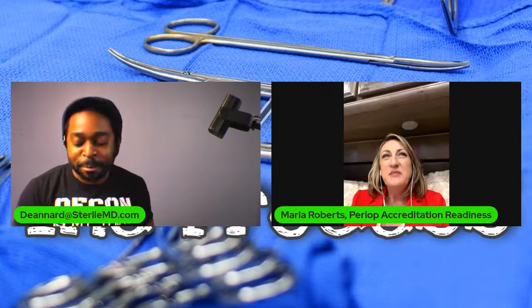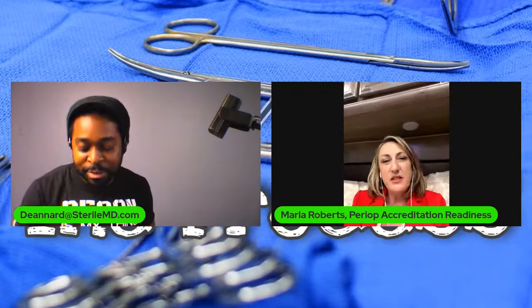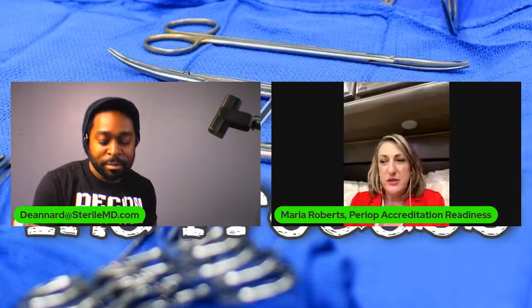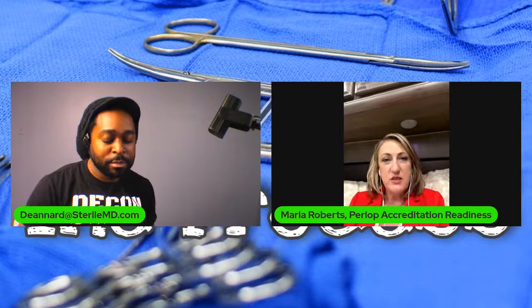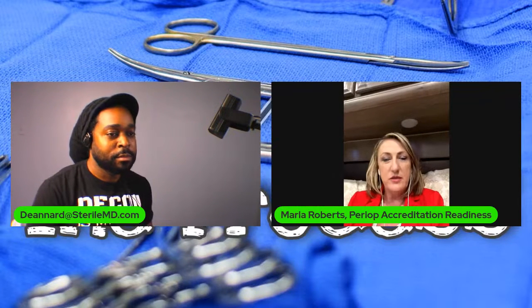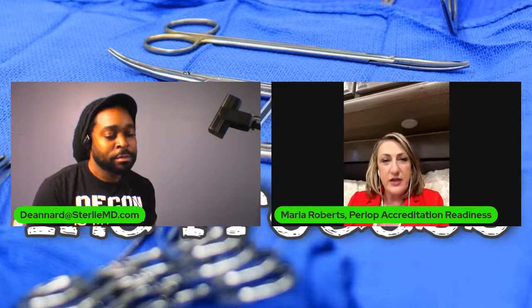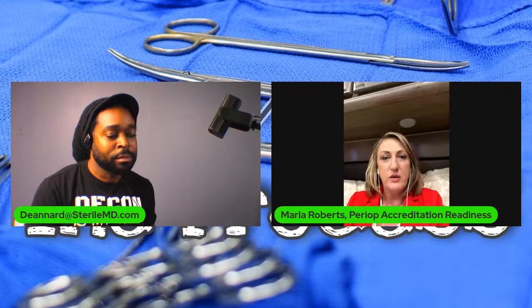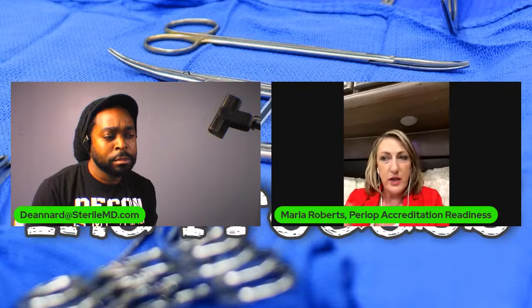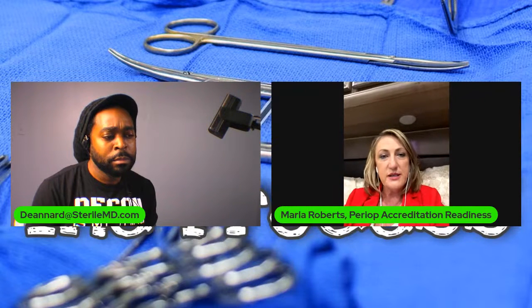I think the problem with metal brushes is that, number one, we're finding that they're scratching some of the instrumentation, or some of the bristles are coming off and they're being sent through the washer, and some are actually caught in them, and they go through the autoclave and they're wrapped that way because they're teeny tiny, and people aren't using their lighted magnifiers when they're putting together sets. And so, with the naked eye, just one little wire bristle is hard to see.